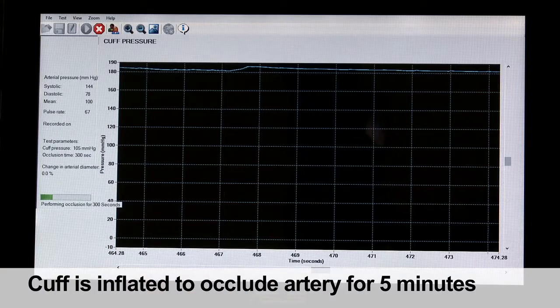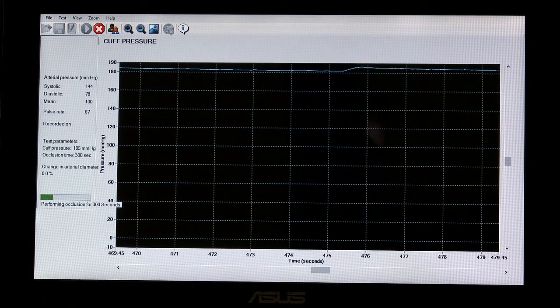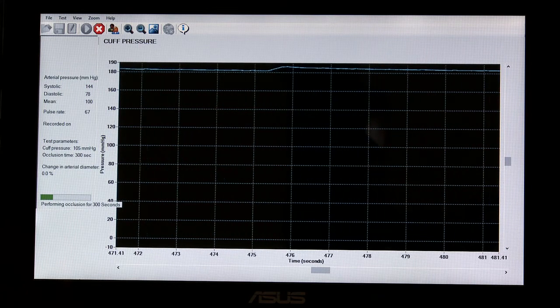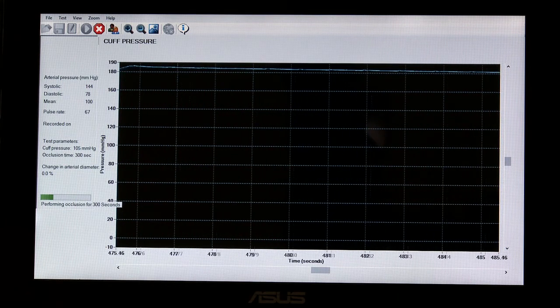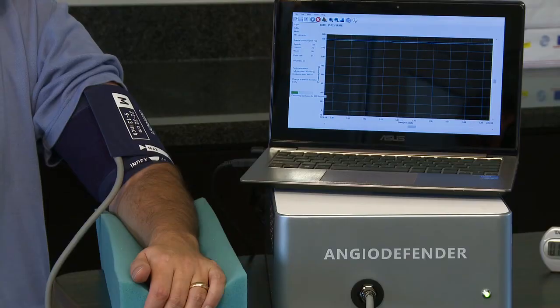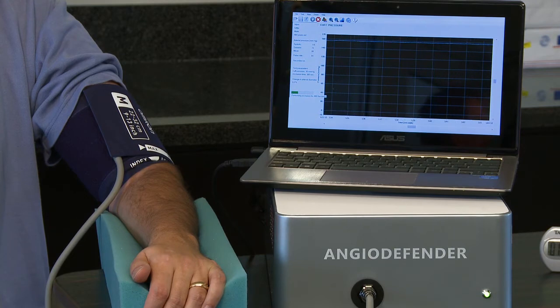Next, the cuff is inflated for five minutes to 50 millimeters of mercury above the patient's systolic pressure. This occludes the brachial artery, stopping blood flow to the arm. The patient is informed that the five-minute occlusion may be uncomfortable and there may be some tingling in the hand or arm, and that while most people can tolerate the discomfort, if it hurts or is too unpleasant the test can be stopped.